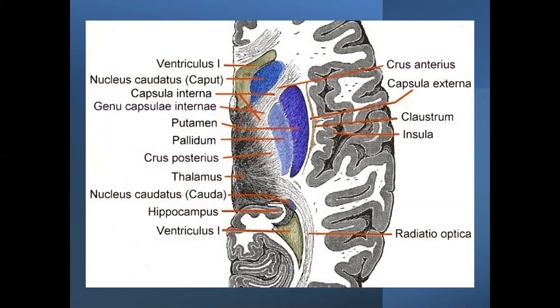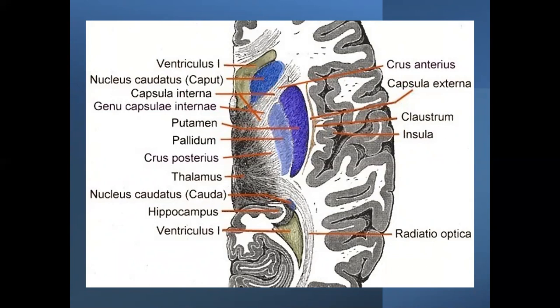On MRI you can identify the caudate nucleus, internal capsule, putamen, and globus pallidus together forming the lentiform nucleus, then the external capsule, claustrum, and insular cortex. You can also appreciate the thalamus, the lateral ventricle, and the internal capsule with its anterior limb, genu, and posterior limb.